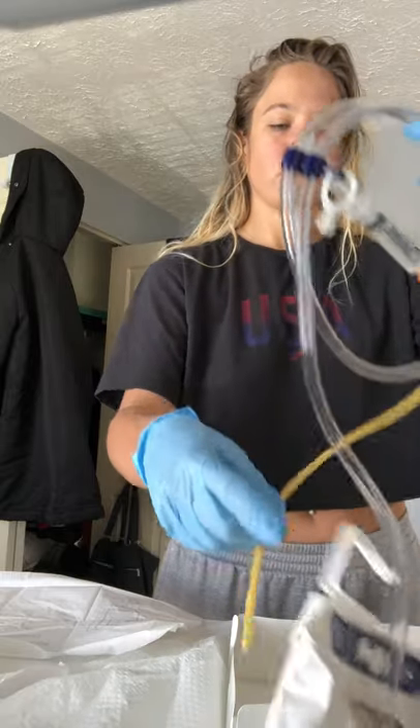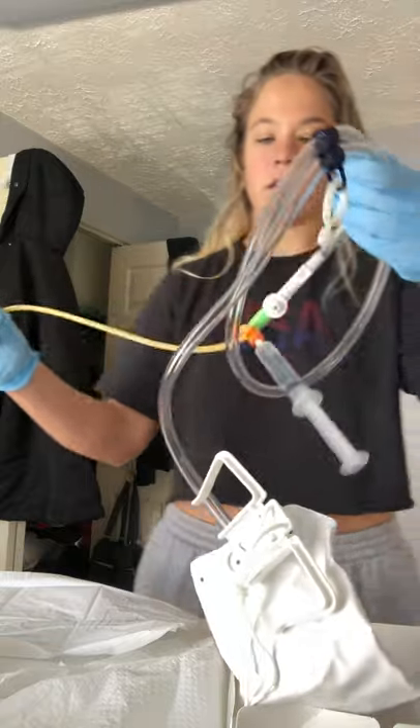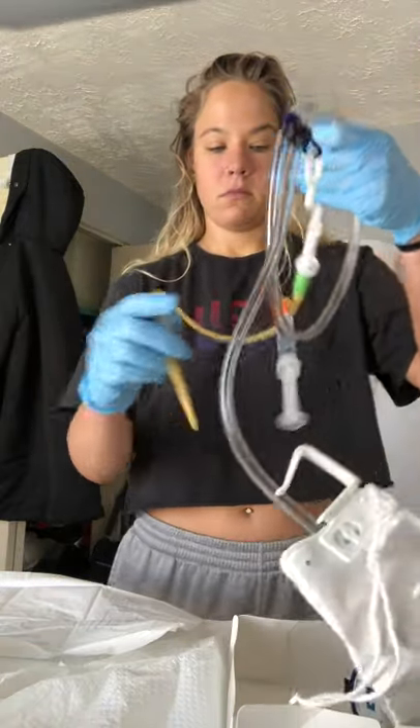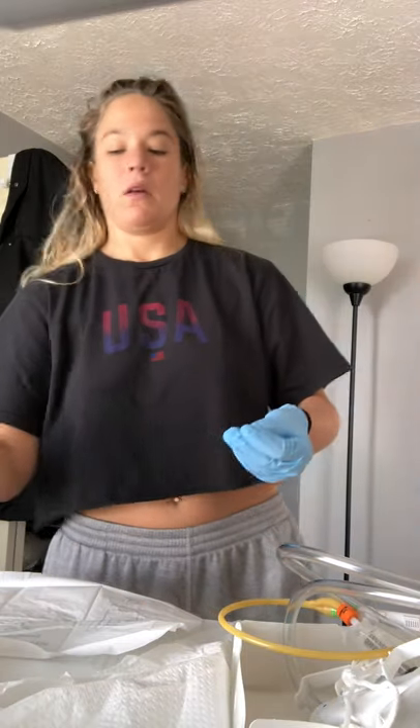I'm going to go ahead and place all of this by the patient, onto the bed. So at this point, I'm going to go ahead and get all of this and go to the bed.